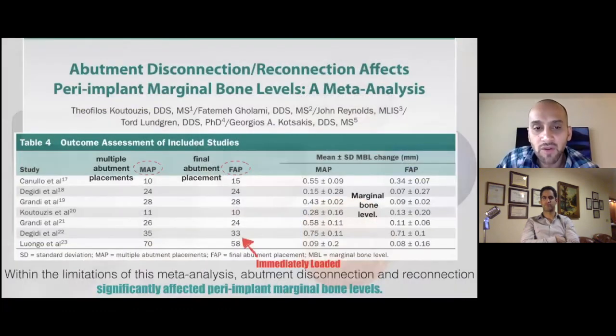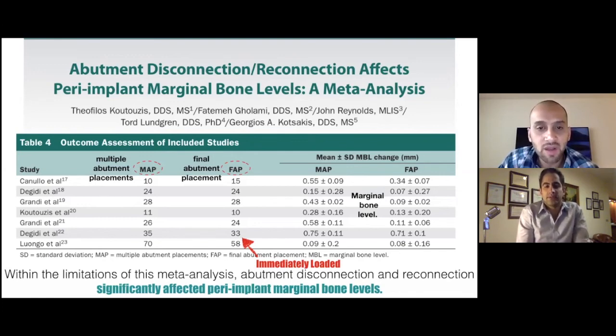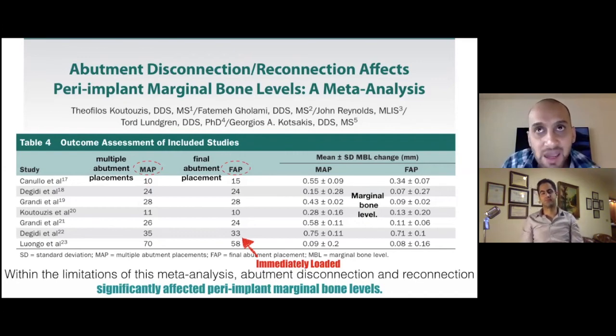And you're familiar with the final abutment concept, the one abutment, one time concept. So I'm going to end my presentation with a case that takes the final one abutment, one time concept into consideration, because we know that there's a couple of studies. This is the one study that showed better marginal bone levels when the final abutment was placed as opposed to when you had multiple abutment placements. So by putting the final prosthesis at the time of surgery and never having to remove it, can that give you better bone levels long term? Yeah, that is the one abutment, one time concept that many people have talked about.